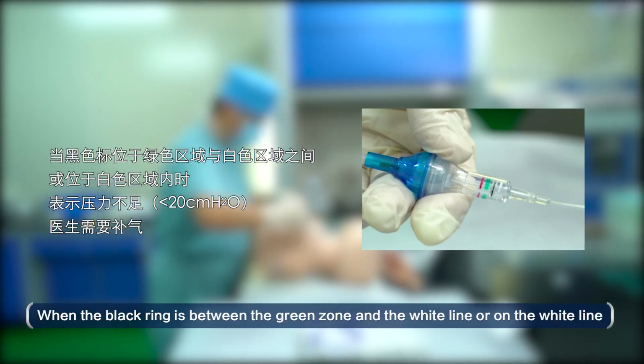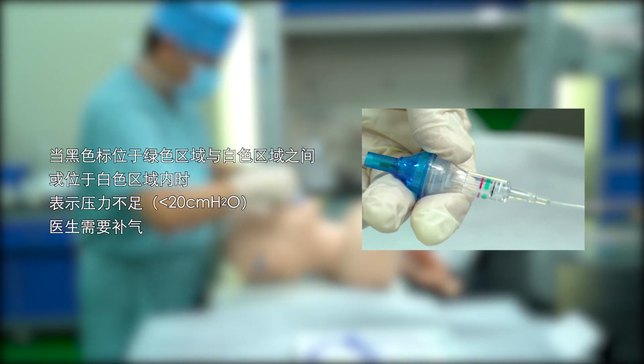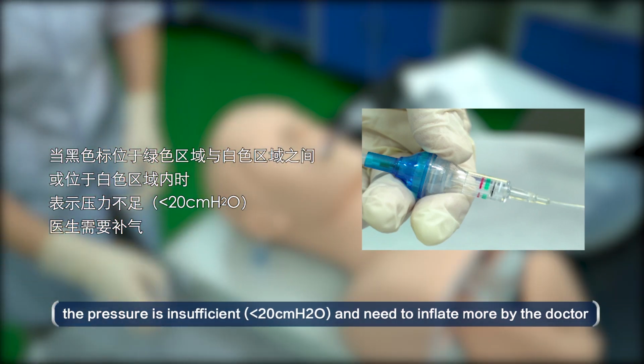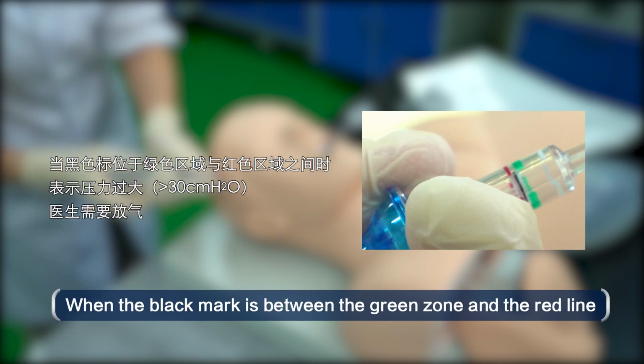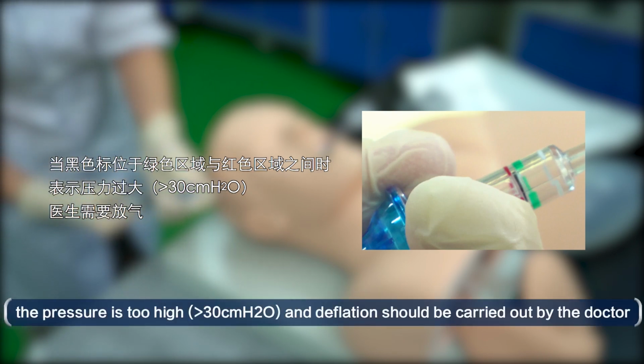When the black ring is between the green zone and the white line or on the white line, the pressure is insufficient, less than 20 centimeters of water pressure, and it needs to be inflated more by the doctor. When the black mark is between the green zone and the red line, the pressure is too high, more than 30 centimeters water pressure, and deflation should be carried out by the doctor.